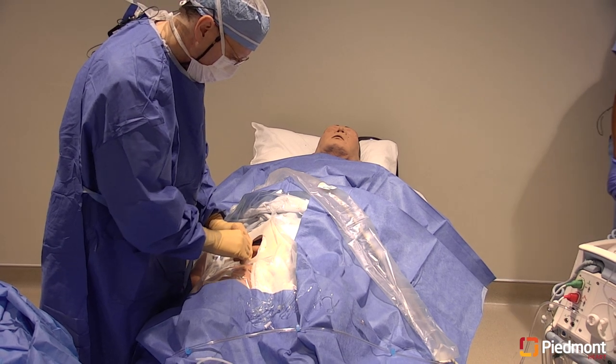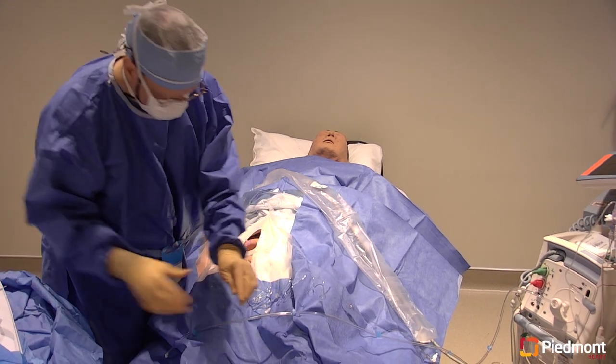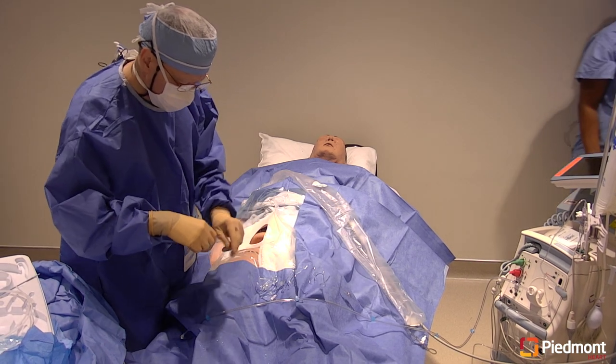While the physician is inserting the balloon pump, the nurse should remain on alert for any assistance that might be required. Also, monitor the patient for discomfort and hemodynamic stability.